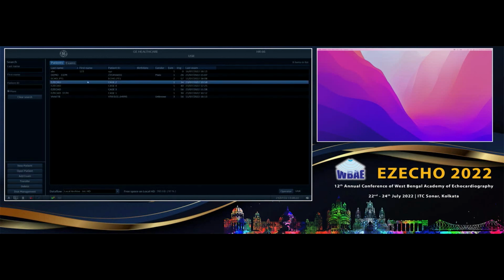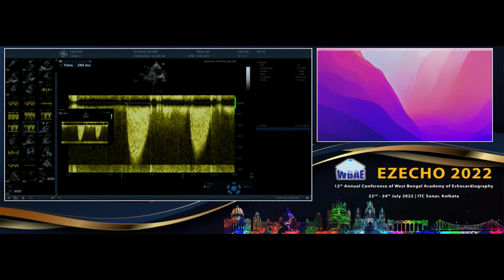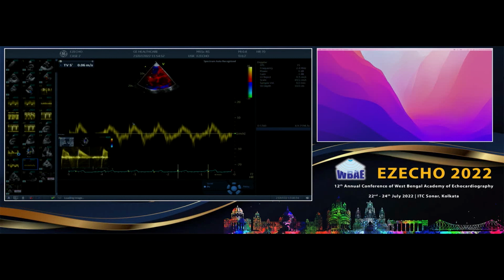No, Nitin, IVRT is only useful now in the recommendation if you have a mitral annular calcification. Calcification, yeah. That is the most important area where IVRT has to be measured. Measured, yeah, because whether it is more than 70 or less than 70. Yeah, can you explain.